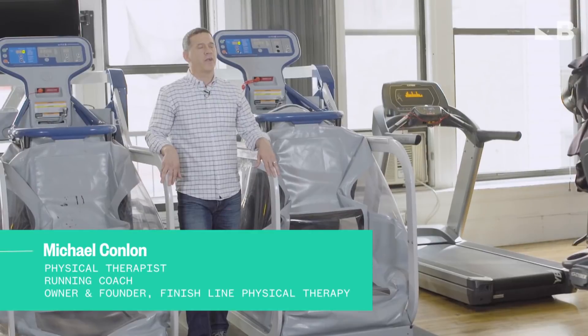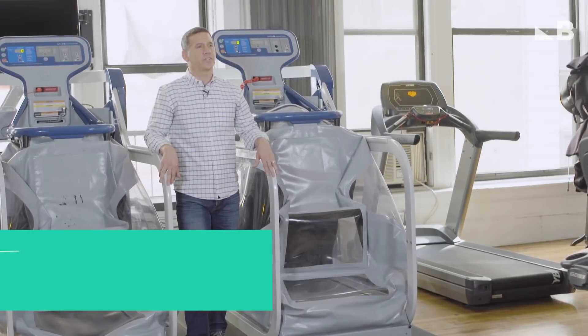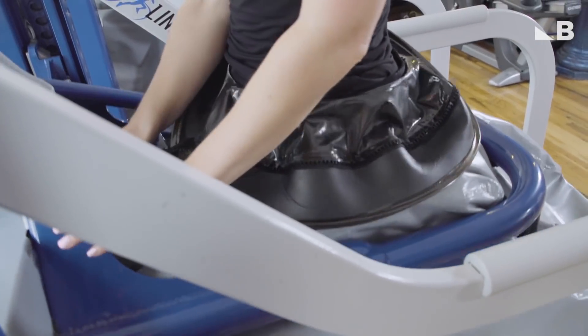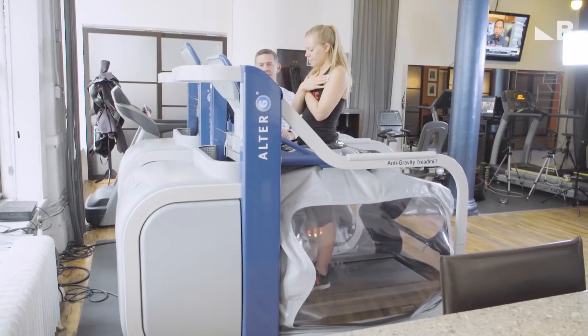Brianna is here with some complaints of knee pain, so today we're going to get her on the Alter-G to see if we can fix her issues. The Alter-G treadmill is a training device, a rehabilitation device. It uses air pressure to unweight somebody by up to 20 to 80% of their body weight. I'm hoping by getting on the anti-gravity treadmill I can diagnose my issue, which may help other people figure out what they're doing wrong so they can have less pain too.